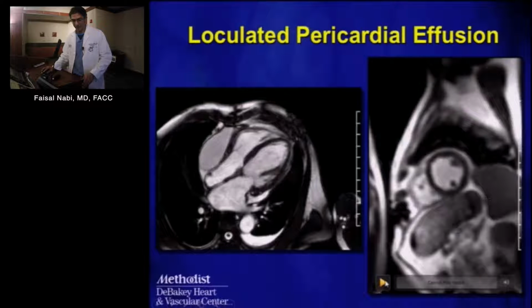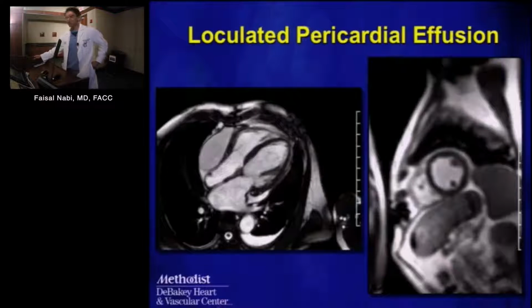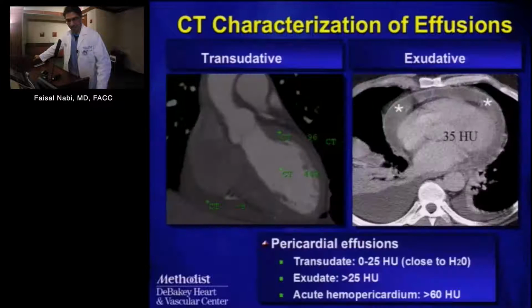Maybe running a little bit slow. Cannot play media. Okay. But I would have shown you one of the markers. I would have shown you ventricular coupling and showing you that this was a hemodynamically significant effusion.